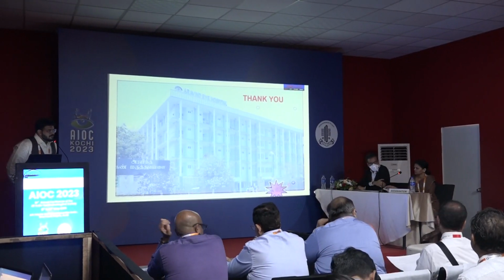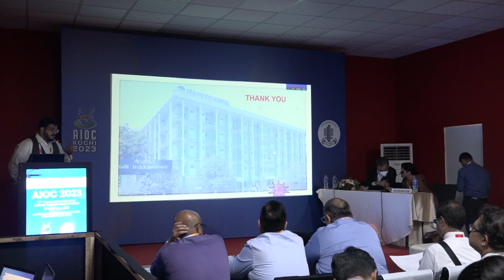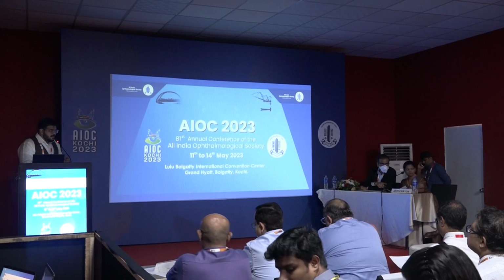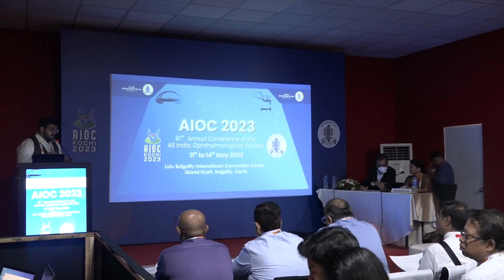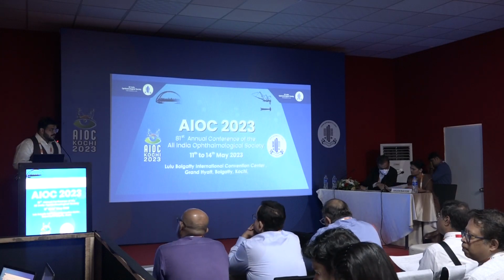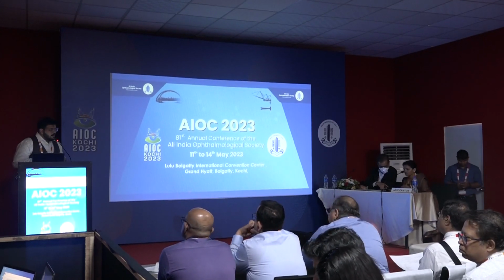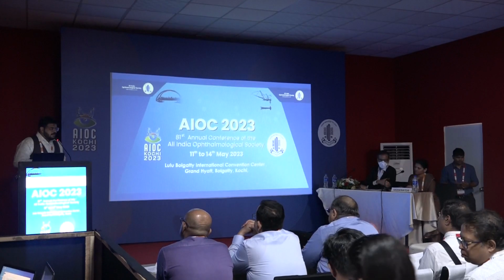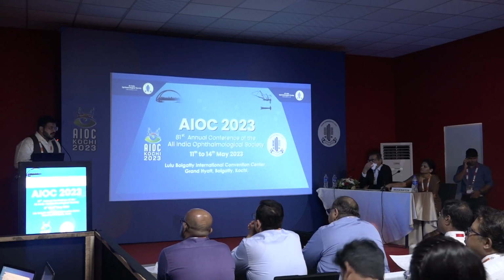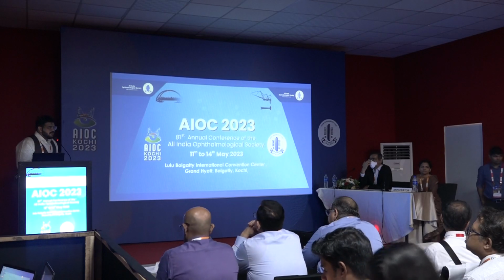What are the challenges that you feel? The main challenge right now is coming onto a definite insulation material. Like I said, we have two cylinders, and the white area that you saw was an insulating material between the two cylinders. We are doing trial and error to find the exact material that can insulate both. Some materials are stable, but after about 50 autoclaves, they disintegrate. We want an instrument that can be autoclaved multiple times and reused. We have almost achieved good hardness, but this insulating material is one of the challenges we are facing right now. But we are making good progress. Okay, thank you.